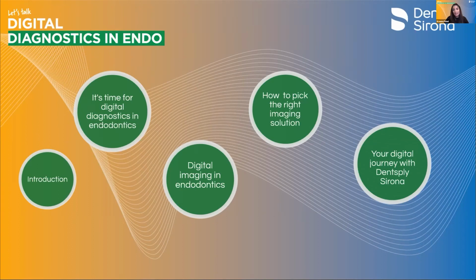So there are three main files involved in this. There's the orifice modifier, which is very similar to an orifice opener, but a lot more conservative. There's the glider files, and then there are the shaper files. And I think it's a fantastic system. It really does preserve a lot more tooth tissue, and we know that trying to preserve more tooth tissue may have big implications in terms of preventing a root-filled tooth from breaking or cracking in the future.